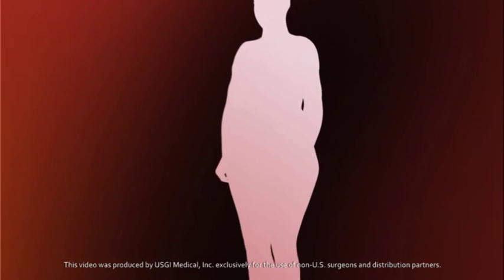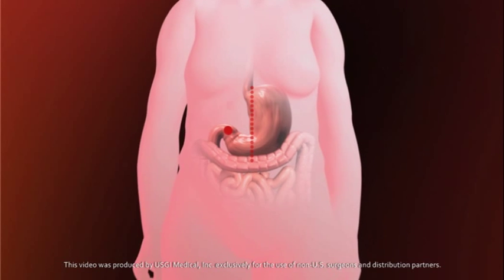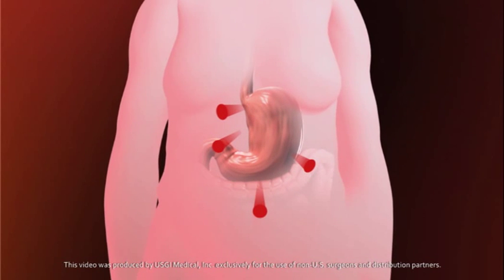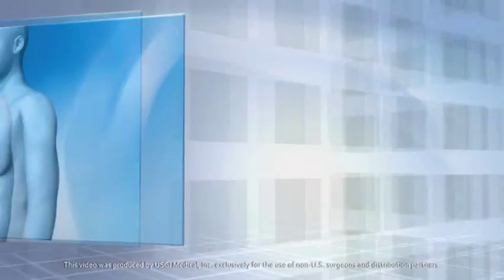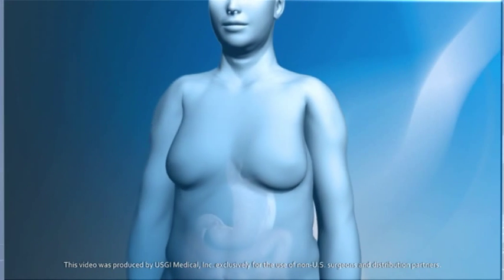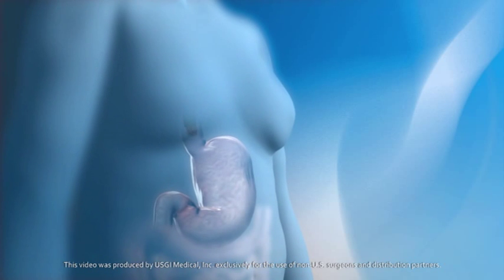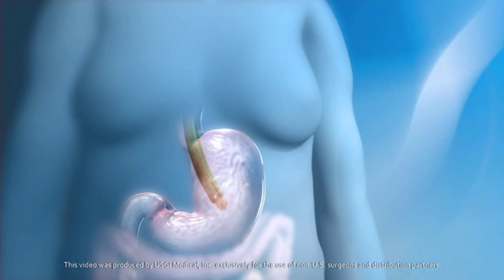Standard weight loss procedures require either a single large incision or three to five keyhole incisions in the abdomen, posing medical risks, some pain, and leaving scars. A new incisionless option is now available called the POSE procedure. POSE stands for primary obesity surgery endoluminal and is used as a tool to help curb your appetite.